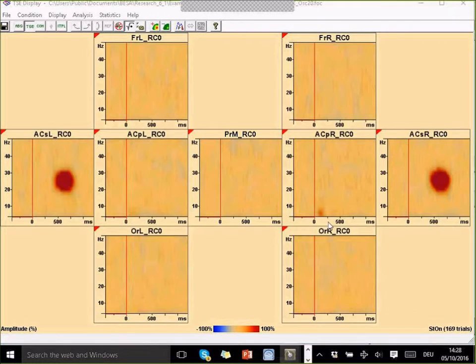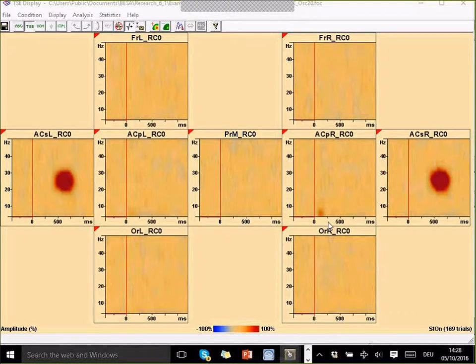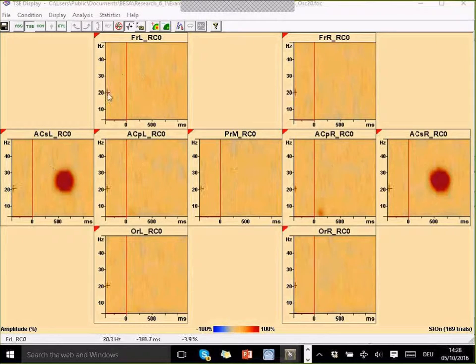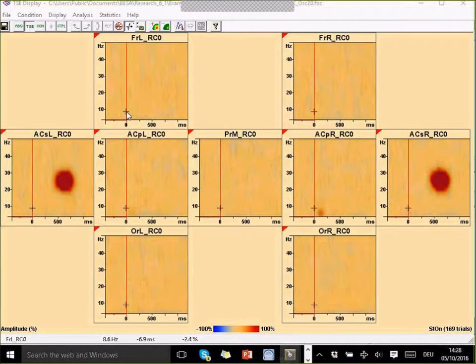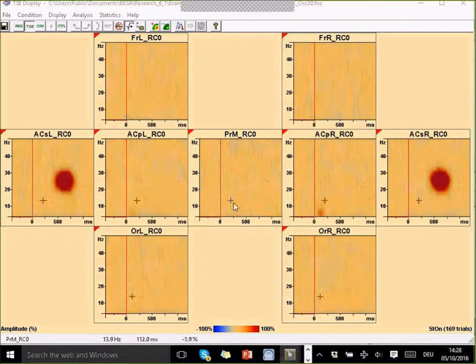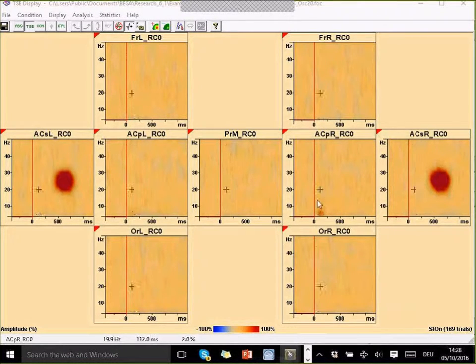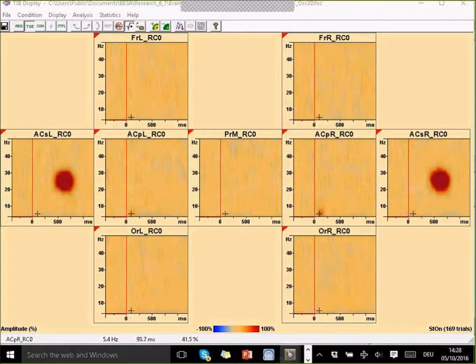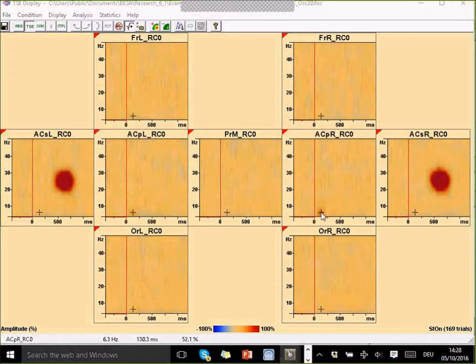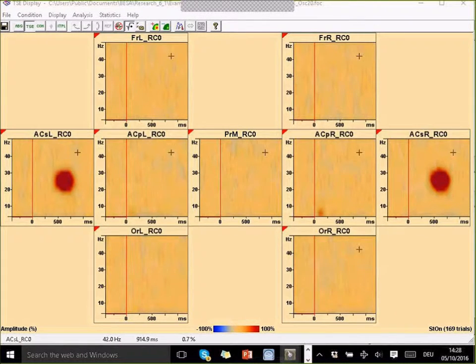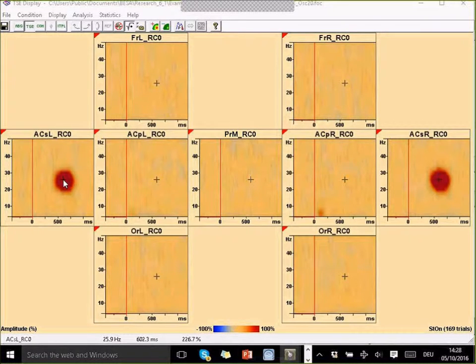This is the result of the time-frequency analysis. Here I can see that I get my nine source channels. I can see the change in activation with respect to the baseline. The interesting thing is that this channel here, the ACPR and the ACPL, these are the channels that actually have the highest response in the evoked potential. And the ACSR and the ACSL with a big red blob, this is the simulated oscillatory activity that is not time-locked.